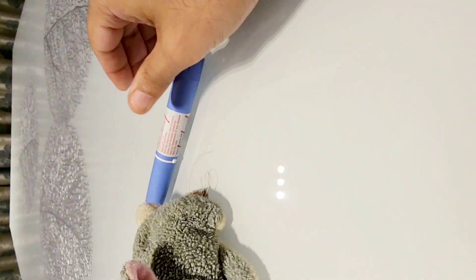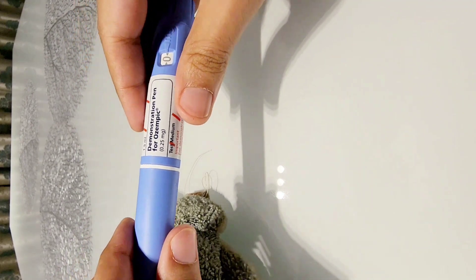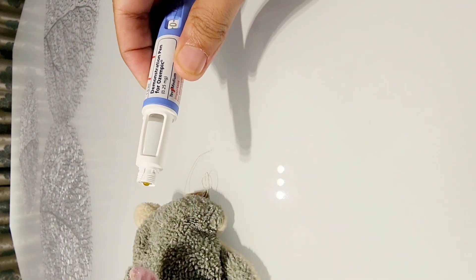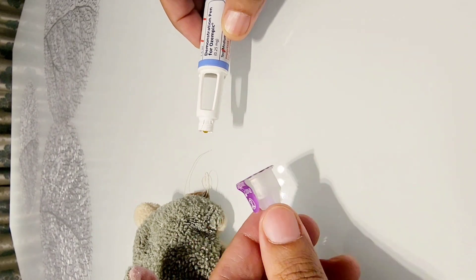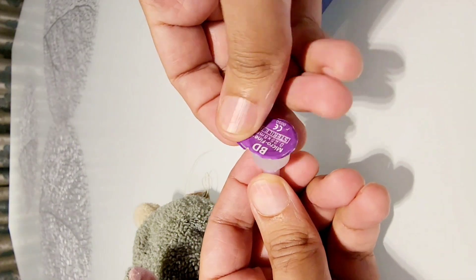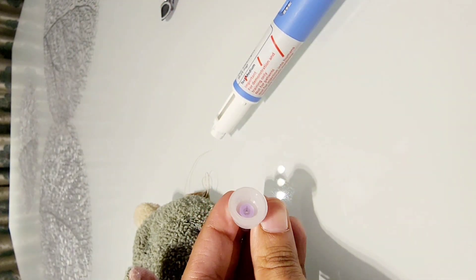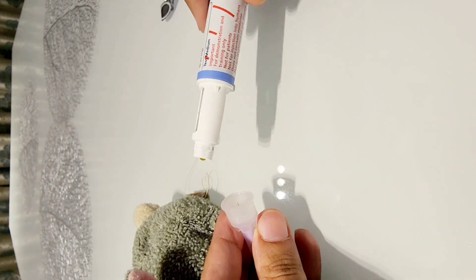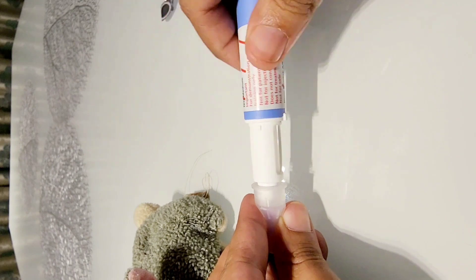Whereas for Ozempic it is slightly different. You would need to attach a needle on the top. The needle is similar to insulin needles as you would see. There is a cover on the top which has to be removed and after removing the cover you see the internal bit of the needle here which goes on this rubber ball on the top of the pen. And this comes like a screw.